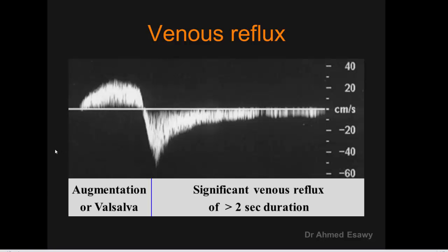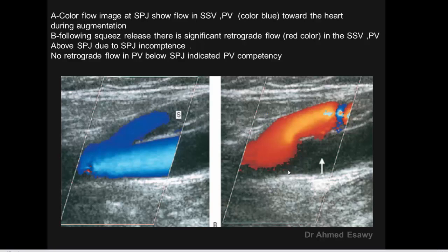This color flow image shows the saphenopopliteal junction — flow in the short saphenous vein coming to the junction with the popliteal vein toward the heart during augmentation. During squeeze-and-release, there is significant retrograde flow in the short saphenous vein and the popliteal vein above the saphenopopliteal junction due to saphenopopliteal incompetence. No retrograde flow in the popliteal vein below the junction indicates popliteal vein competency.